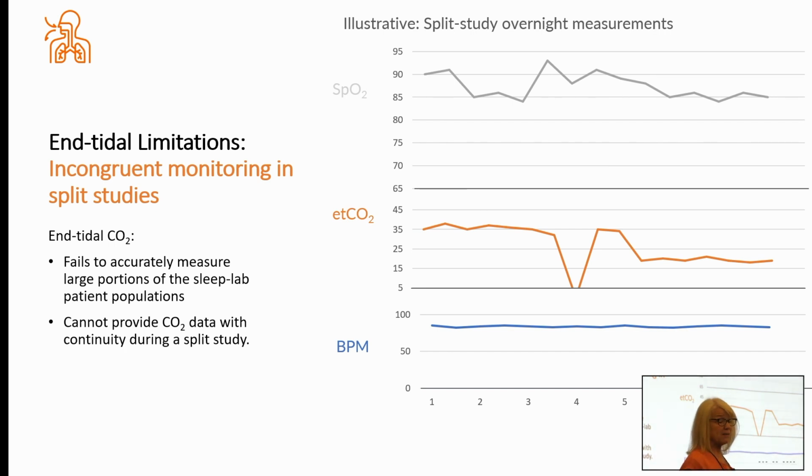In the beginning of this study, we see that the patient's CO2, and here's where the mask use starts. Now, in the beginning of this study, we see the patient's CO2 right around 35, 37. That looks pretty good. That should look pretty good to most of us. That's usually what mine is. But consider if this patient had a VQ mismatch, then this is actually an underestimation of their CO2, and you're going to use this as your baseline for the rest of the study.